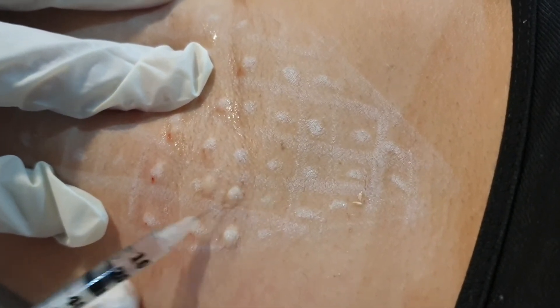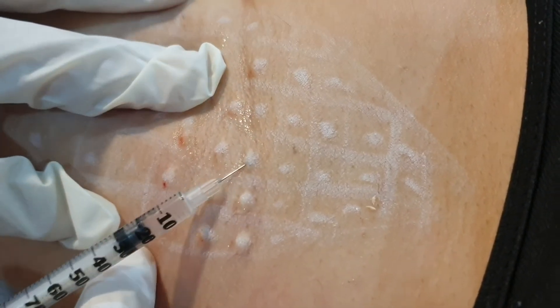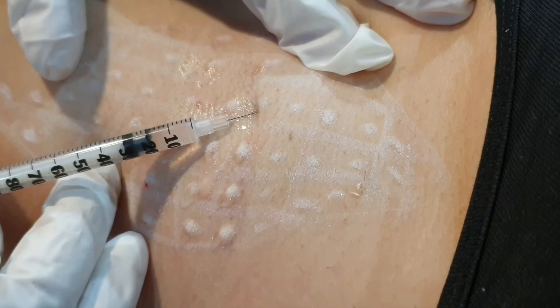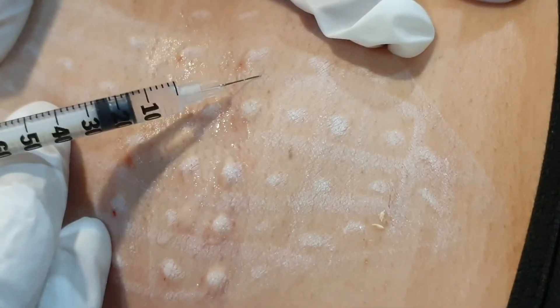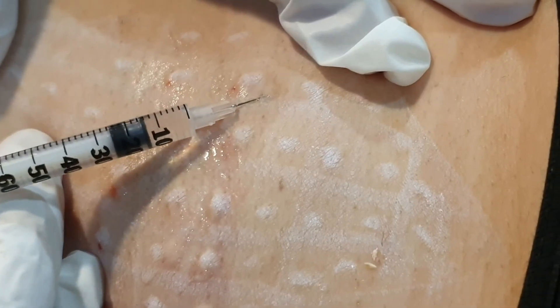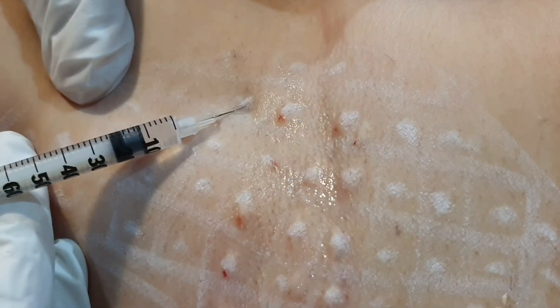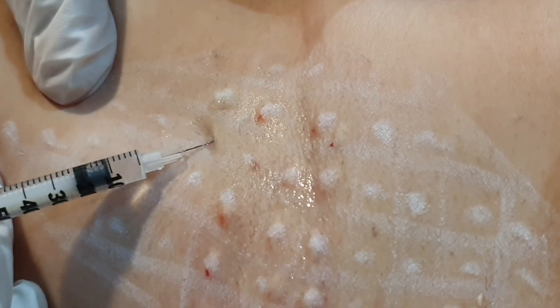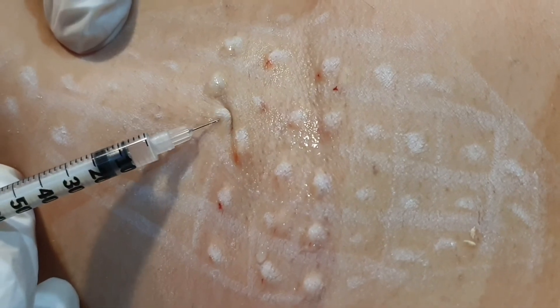Like this — like that. And this, this is intradermal injection.